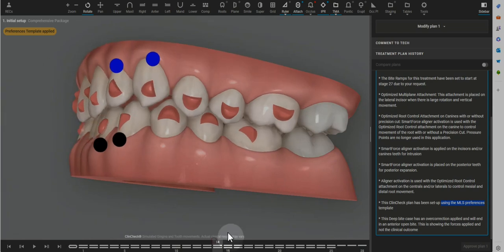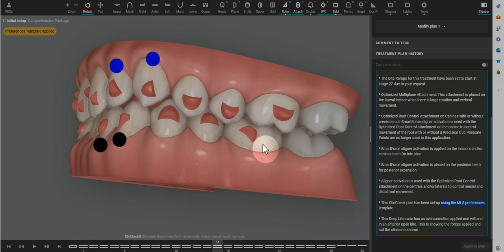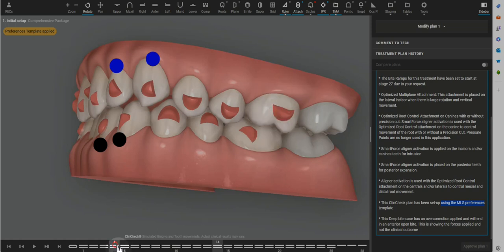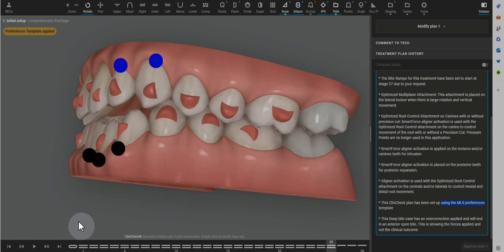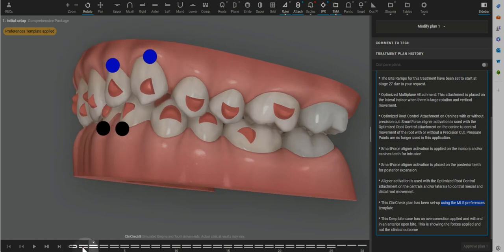I would say for this doctor that prefers to use the MLS template, by all means, extrude the maxillary molars. It's only going to help with establishing a better solid final molar occlusion, but do add the bite ramps all the way through.